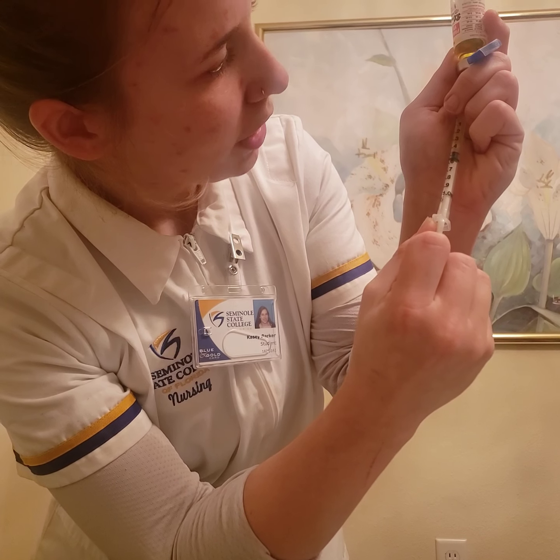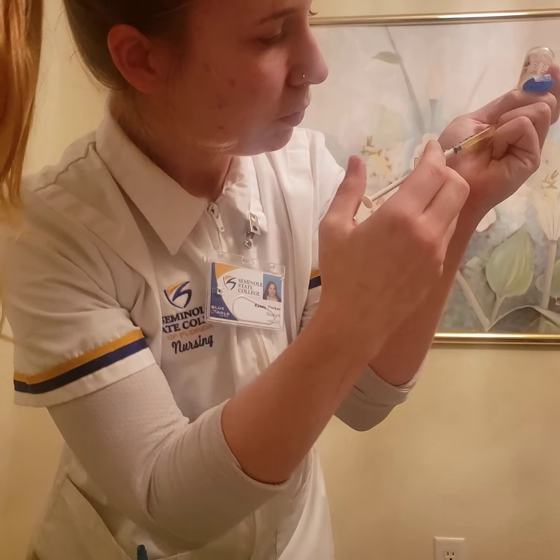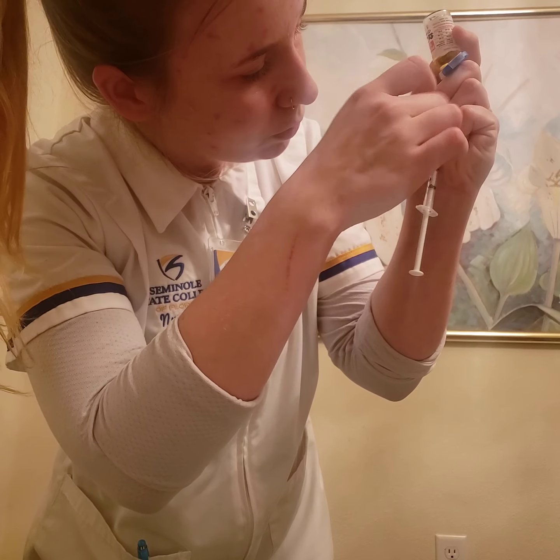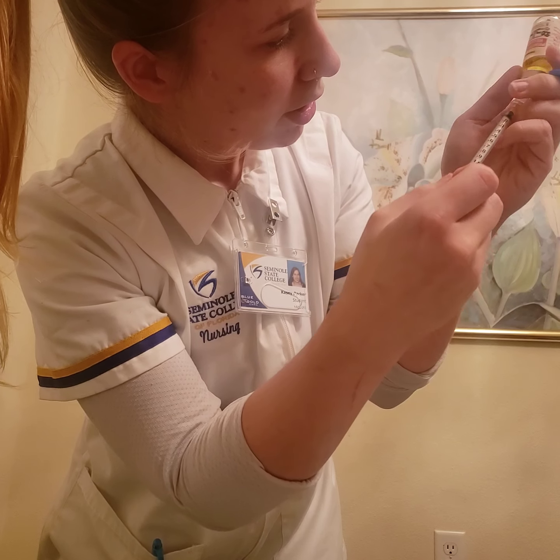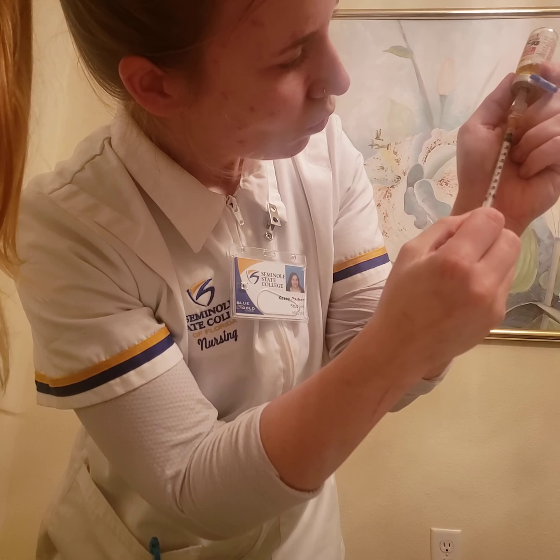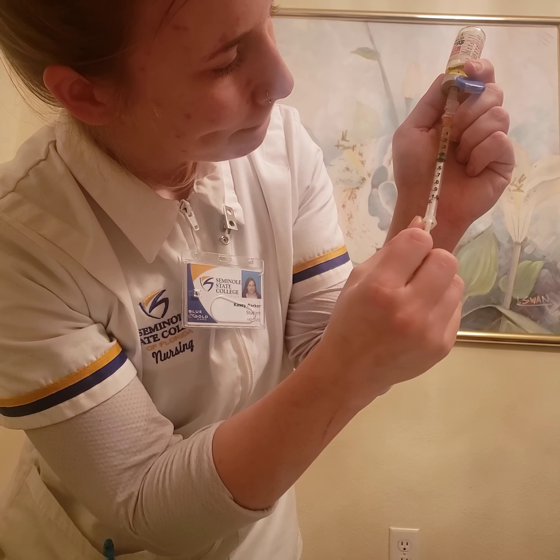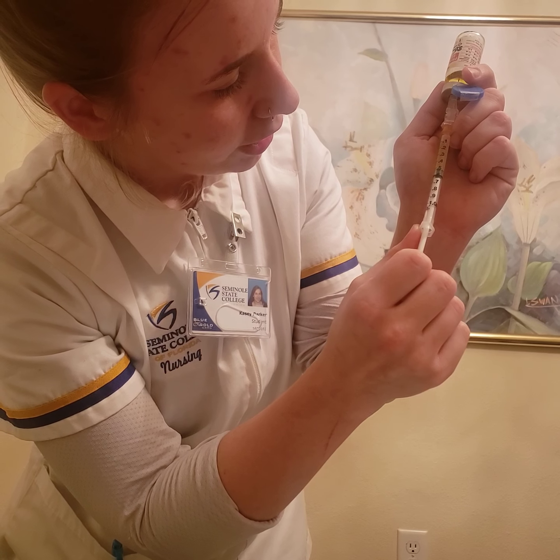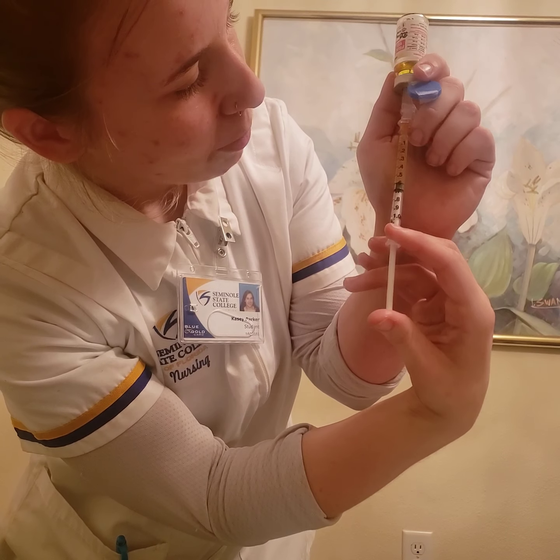I've got an air bubble, that's okay. Let me go back. Okay. There we go. Now I'm going to pull back so that I can get the equivalent of 0.5 milliliters and inject that air at the top back up.